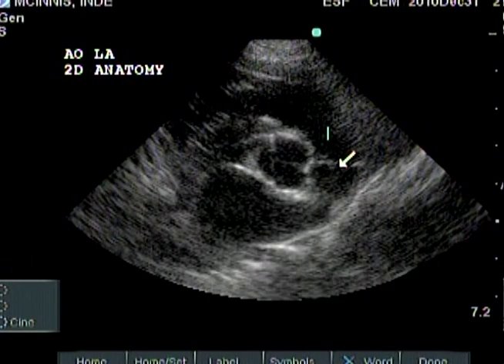Directly below the aortic valve is the left auricle and the left atrium. In dogs, the left auricle at this point is about the same diameter as the aorta. In cats, the left auricle can be a little larger than the aortic diameter. The left atrium is actually below and to the left of the aorta on the ultrasound screen. The right atrium and tricuspid valve are to the left and above the aorta.